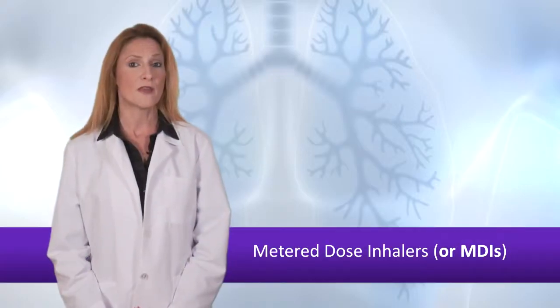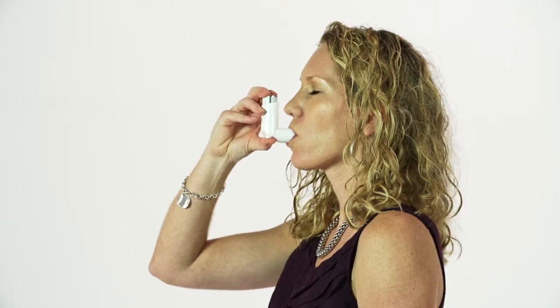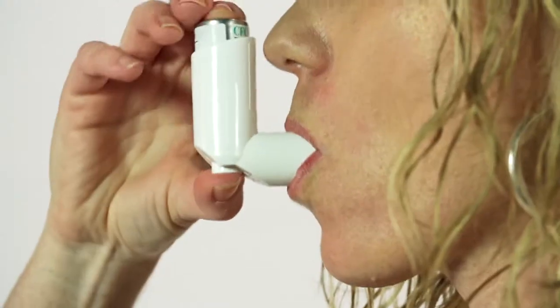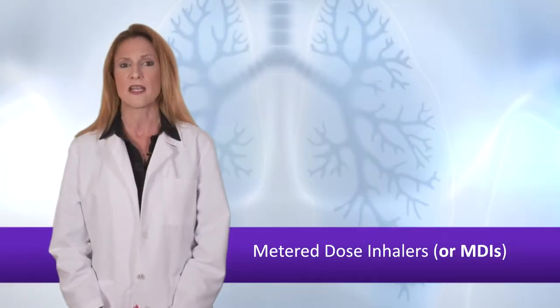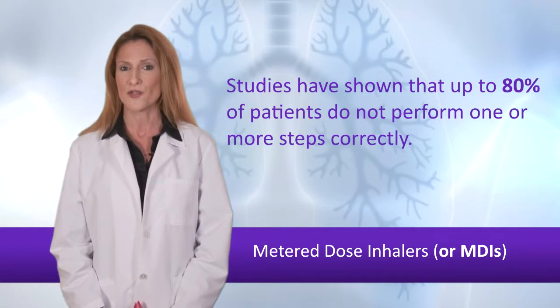Inhalation is the standard method for administering respiratory medications. The advantage of inhaling medications is that there are fewer adverse reactions than from taking oral medications. The major limitation to inhaled delivery of medications is that good inhalation technique is necessary for the drug to reach the lungs. Good technique is tricky.